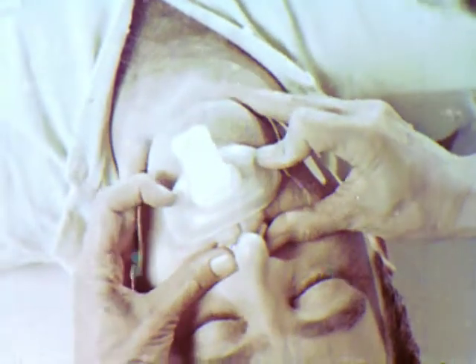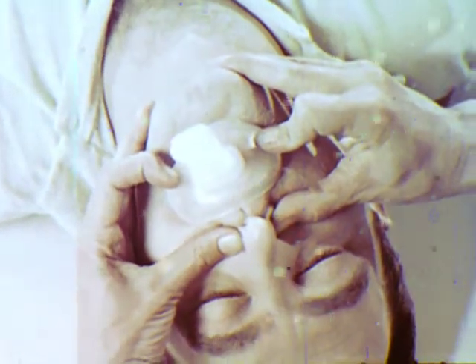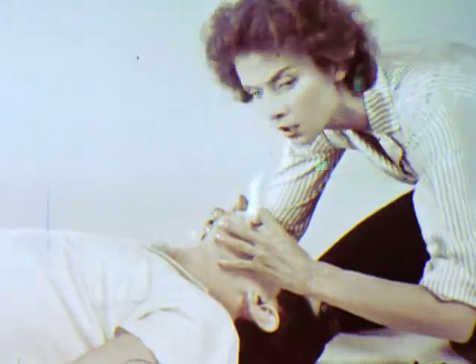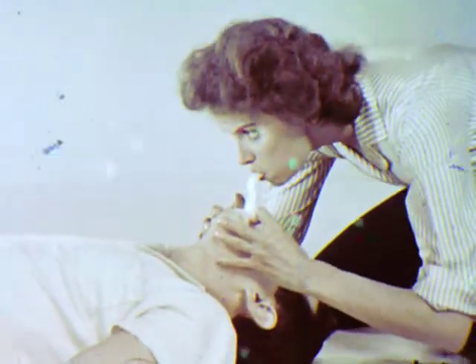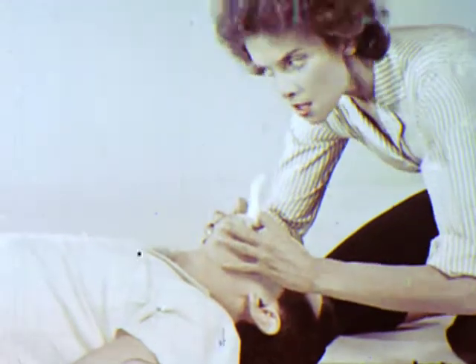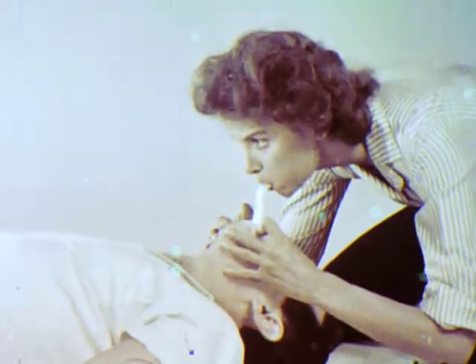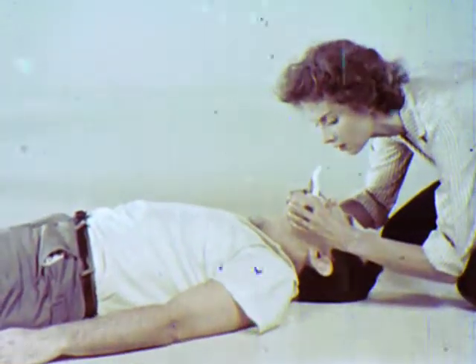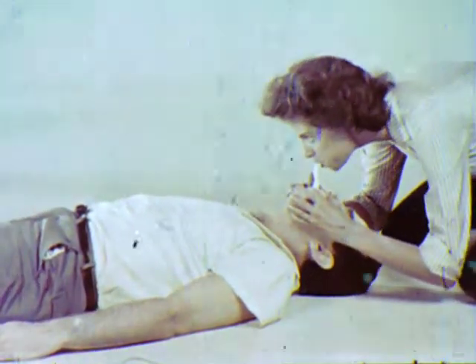The flange should be cupped over his mouth. Pinch his nose with your thumbs. Press the flange over his mouth with your index fingers to prevent air leakage. And pull the chin up and toward yourself so that his head is tilted backward. Take a deep breath and blow into the mouthpiece of the resuscit tube. Watch the victim's chest at all times. Blow very forcefully into an adult. Blow gently into a child. When his chest rises, pull off and let him exhale by himself.